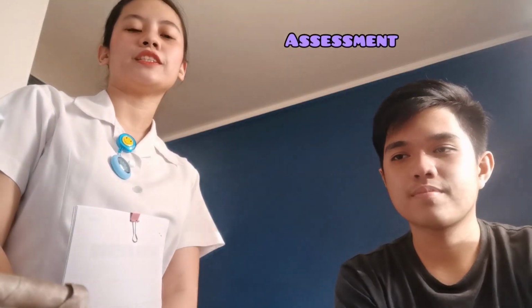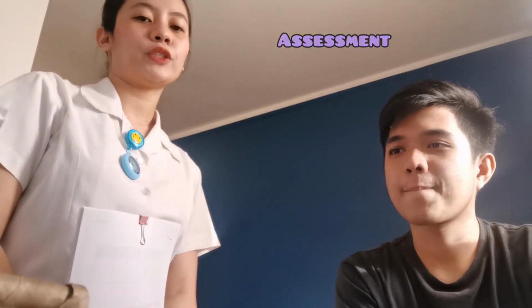Nikki M. Valdez. I'm a first-year student nurse, and for today, I will be performing vital signs monitoring and recording. Before getting the vital signs, first of all, we need to assess the patient. So the first step is to identify the client.